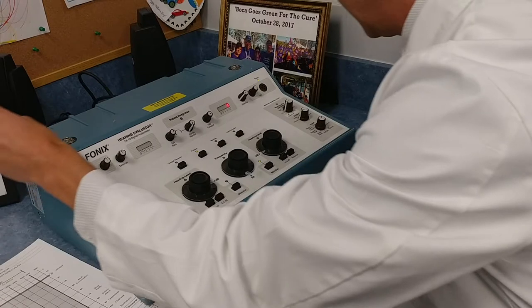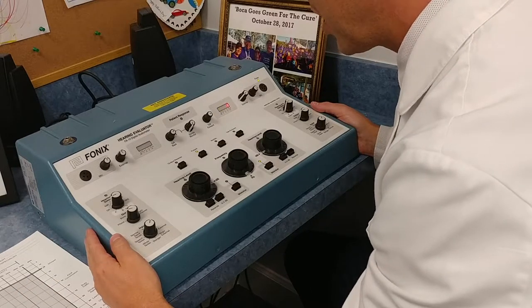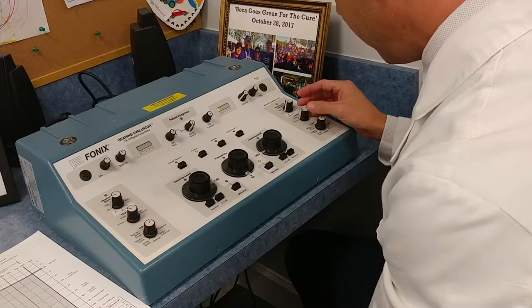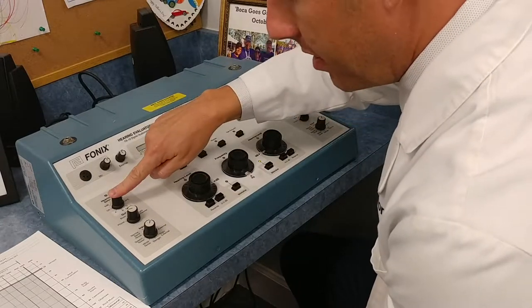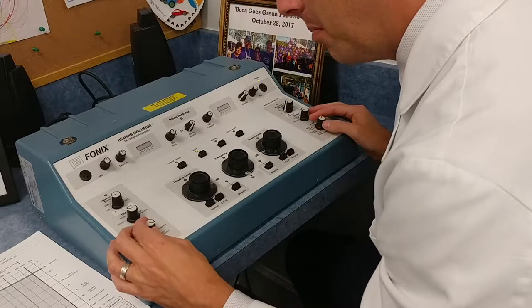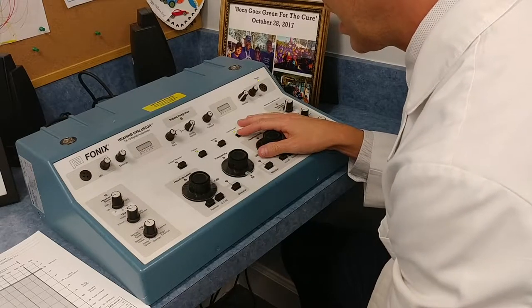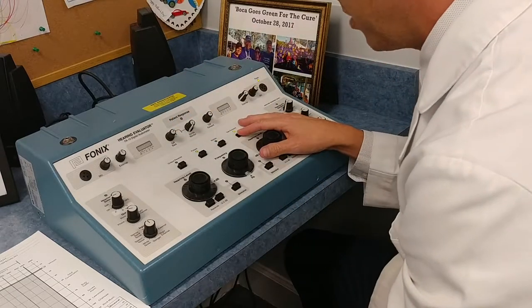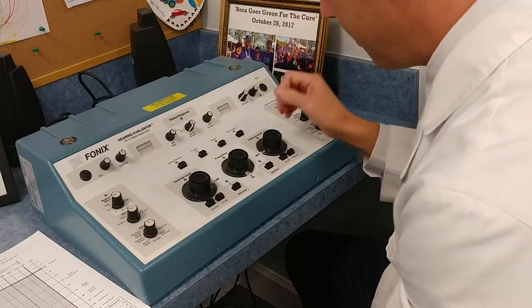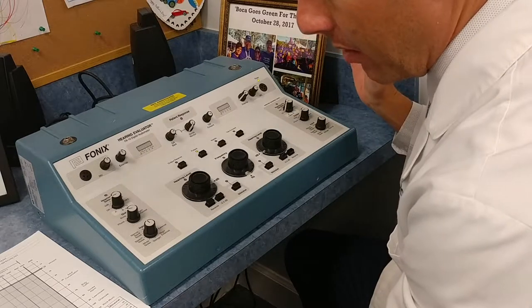I'm going to be utilizing the older audiometer here — no matter what you're utilizing, you'll find these parts on your equipment. First, I'm going to make sure that my hearing aid simulator is off, my output is on phone, and my input is on tone. Now when I hit talk forward, because the inserts have been placed into the patient's ears, they're going to hear me. I can adjust my volume to make sure it's comfortable, and I'll make sure that their microphone or button is enabled. I'm going to let them know that I'm starting with their right ear.